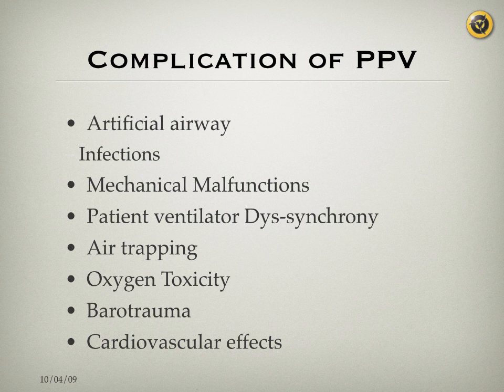Patient-ventilator dyssynchrony is another problem. I mean, the patient is bucking the vent, or the vent is not delivering the tidal volume that's supposed to be delivered, and so on. And in this case, the patient is not relaxed enough to follow the ventilator, or the ventilator is not set to follow an awake patient.